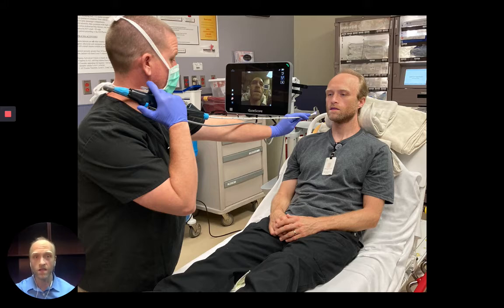making it more challenging. So before inserting your scope, you want to ensure that your patient is positioned appropriately and that you are comfortable. If possible, have your patient sitting up to close to 90 degrees and in the ear to sternal notch position to optimize airway alignment. Ensure that the screen is arranged to maximize your comfort. Position yourself to keep the flexible endoscope midline and straight.